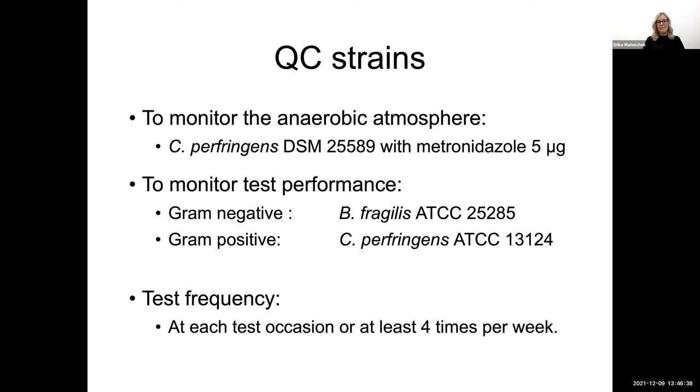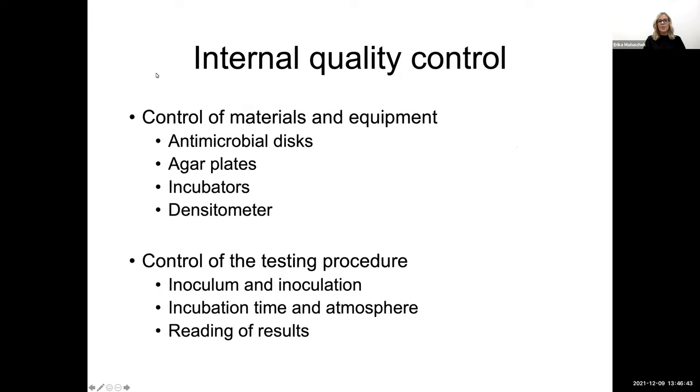Next, please. Just to remind us that the internal quality control will control not only the materials and equipment used, such as the discs, the plates, the incubators, but also control the testing procedure to see that the methodology is adhered to. And as with any standardized methodology, it's very important to strictly adhere to the methodology without any modifications, as the change of any parameter will also change the end result.